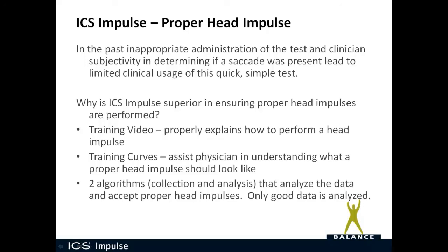Why is ICS Impulse superior in ensuring proper head impulses are performed? You've got all these training videos that properly explain how to do a proper head impulse. You've got the training curves which assist the physician or technician in understanding what a proper head impulse should look like. And then you've got the two algorithms, the collection and analysis algorithm, that analyze the data and accept proper head impulses. Only good data is analyzed, and that's very important.